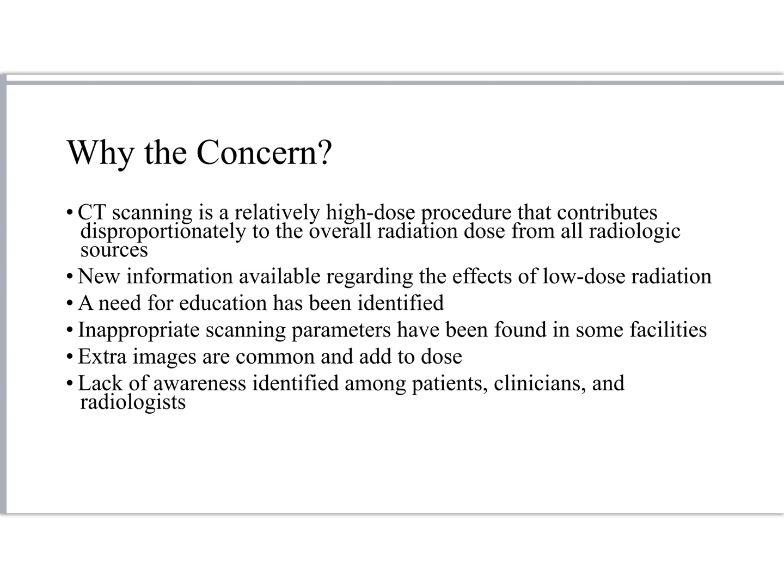And those base level values were actually over-irradiating people, and technologists continued to hit the go button on these CT protocols that were systematically overexposing people. Of course, extra images, any kind of looky-loo type stuff, just overall lack of awareness. I think there's almost some nihilism here, where we're just like, oh my goodness, that's a lot of radiation, and we just kind of stop caring, ironically.